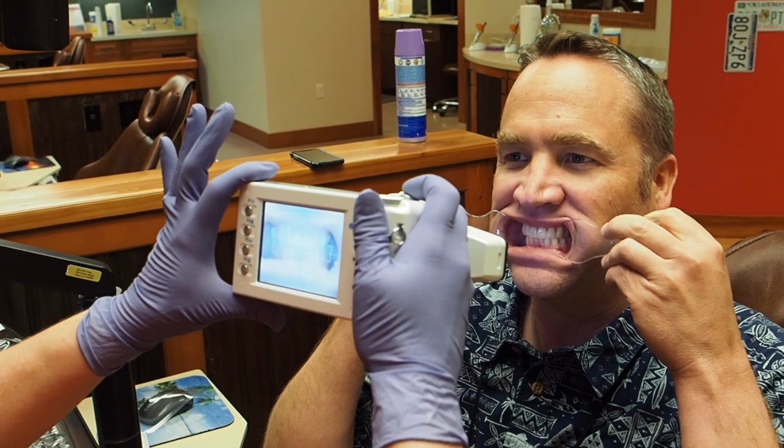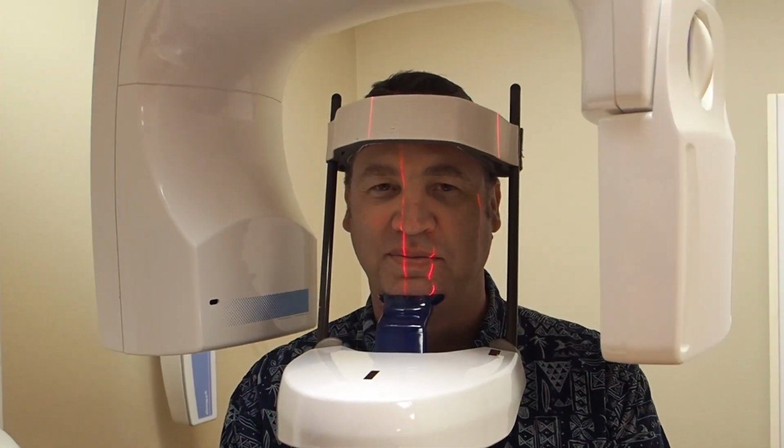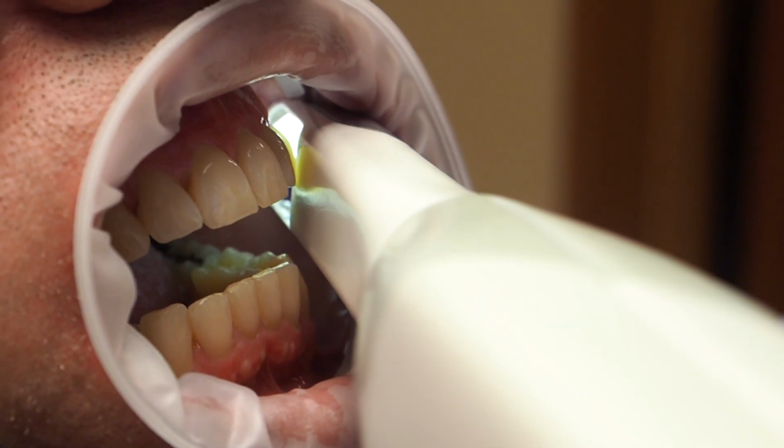There's a lot of information that goes into developing an orthodontic diagnosis and an individual treatment plan. We look at pictures, we look at x-rays, we even look at a 3D representation of your teeth. So let's go to the computer and I'll show you how we use that information to develop a diagnosis and a treatment plan.